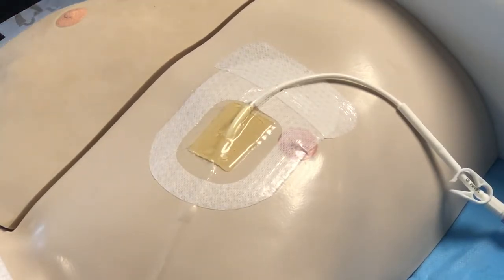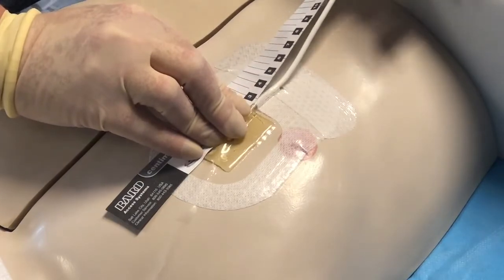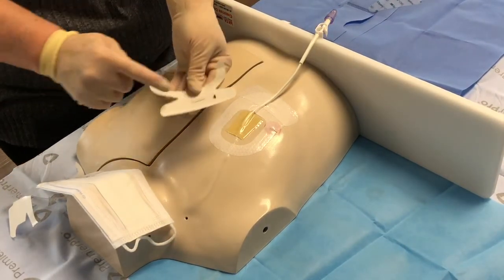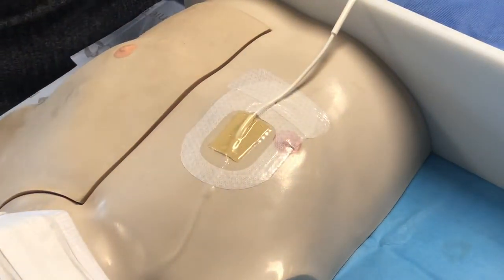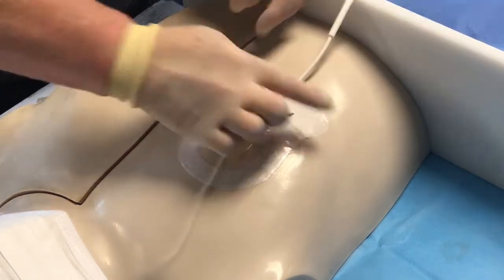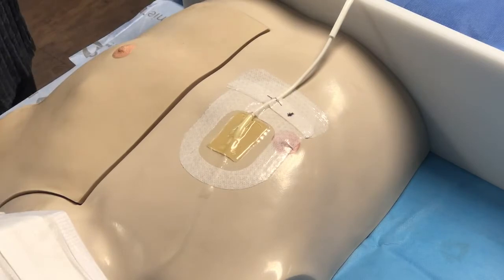Remeasure the external length of the catheter and compare to documented length. Document date, time, initial, and catheter length on the documentation strip and apply to the dressing in a place where the insertion site is not obscured. Remove gloves and perform hand hygiene.